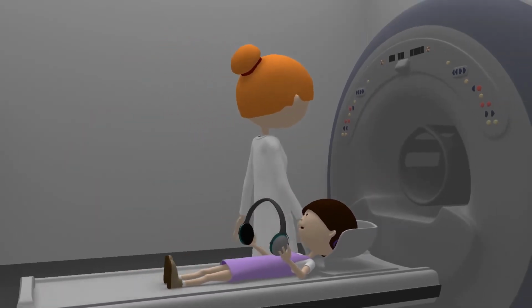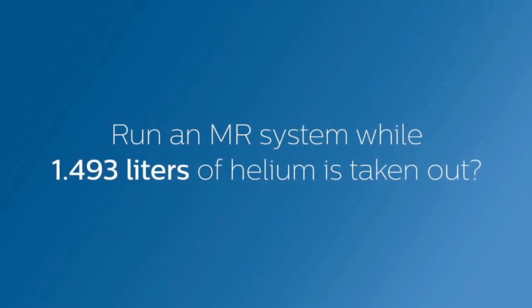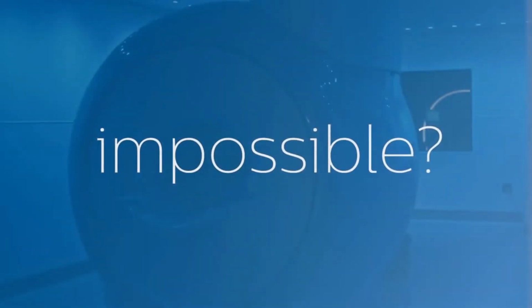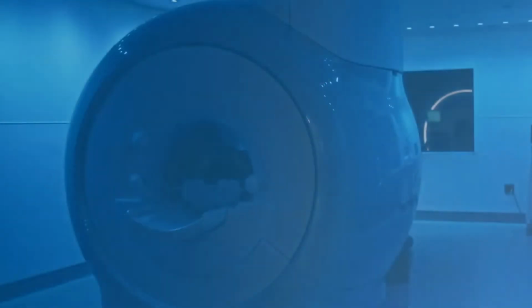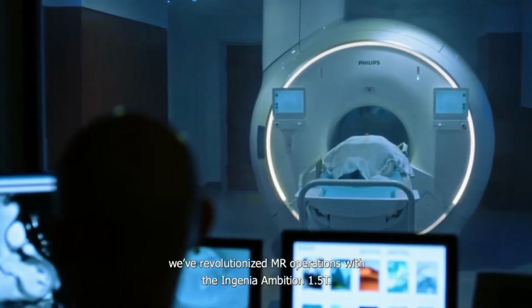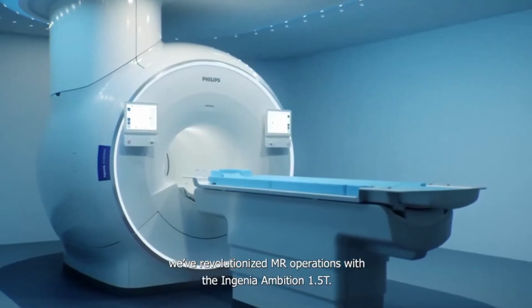Let's end this video with Helium-less MRI machines. Critical in the use of high-field MRI scanners, which use helium to cool the superconducting magnets to 4 Kelvin or -269 centigrade, the declining availability of helium is causing waves of concern across the research and medical field. Standard high-field MRI scanners not only require hundreds of liters in which to bathe the superconducting magnet, but need regular top-ups as helium leaks away.